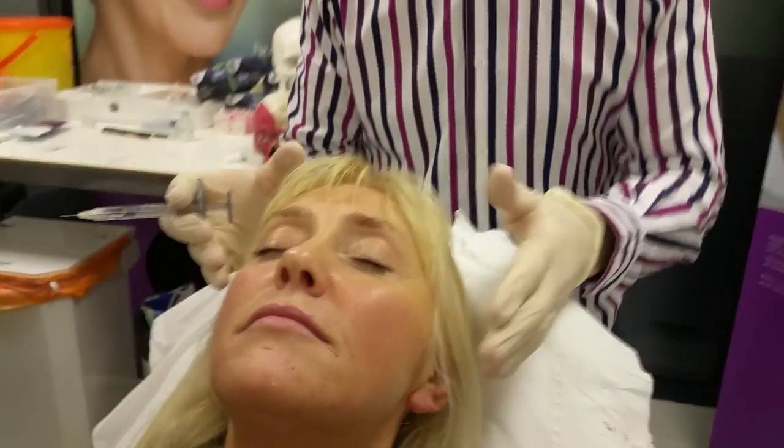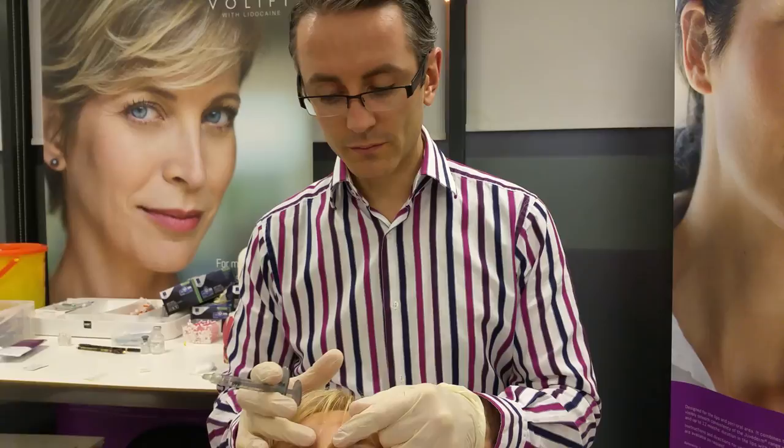We're treating frown lines on the glabella, which is a really important area because of the artery that lies directly underneath. They have two supratrochlear arteries which unfortunately run exactly underneath the crease that we're trying to treat.